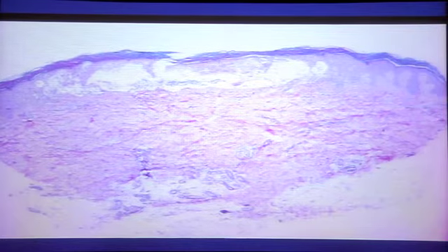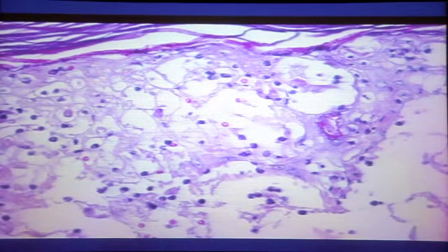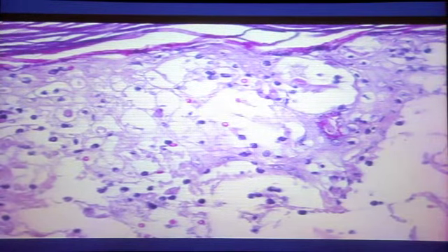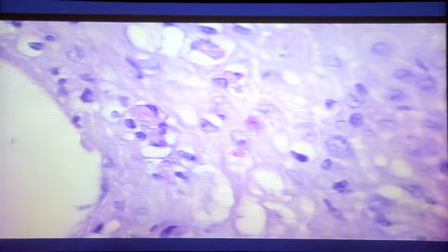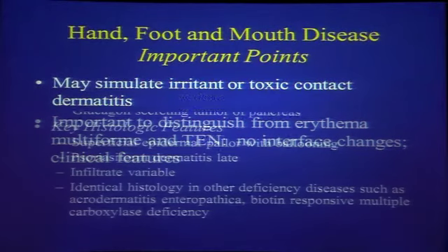You see the, again, blister. It's an intraepidermal blister, and then at higher magnification, you see the cells are swollen. So this is ballooning, and when these little balloons in the epidermis pop, they leave these little residual amounts of the cell membrane here, and it forms this little lace-like reticular network, and we refer to that as reticular alteration. Reticular means net-like, and that's very characteristic of ballooning degeneration, very characteristic of what we see in these viral vesicular dermatitis. So anyway, just remember that.